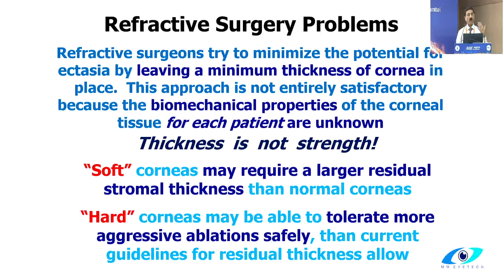And I recall a patient that I did, he had 22 diopters of myopia. And I told him, you'll have some residual myopia left, and I did 18 diopters of ablation. This is going back to 1995, I think it was when we started. Patient's fine. He's got 180 microns of residual corneal bed, which in today's day and age would be criminal. So at a time when there were no guidelines, there were no biomechanics, we only had corneal topographies, LASIK had come in, and this is how it was being done.